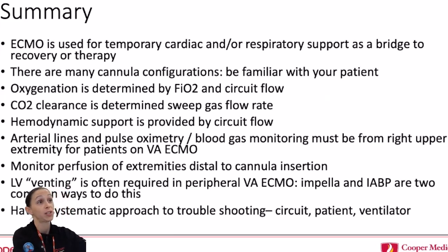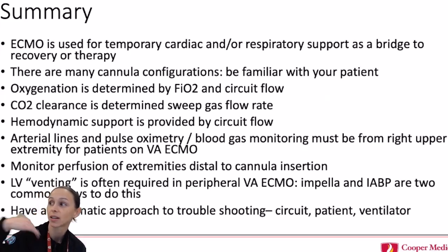Really though, the most distal site would be left radial, and that is what the paper said, because technically you're flowing towards this hand, and you're relying on it this way. Yeah, I think that one gets really tricky. I think we did left radial. No, we looked at both. There was a table in a paper I pulled, and it had every cannulation configuration, and for right axillary it said to do left radial.